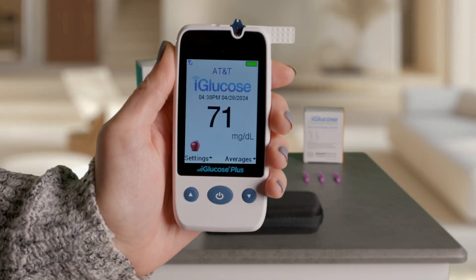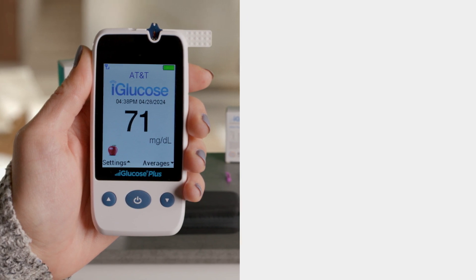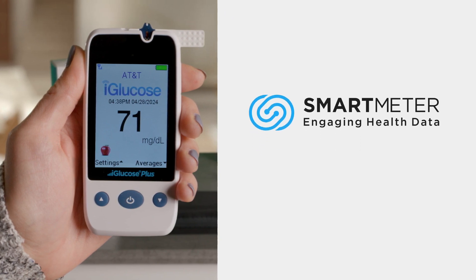That's it! You've successfully taken your blood glucose reading with the iGlucose Plus and your results are on the way to your care team.